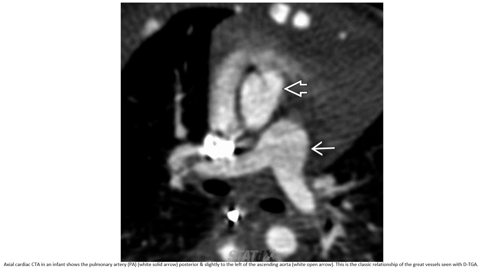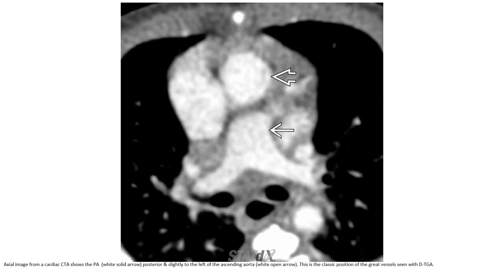Axial cardiac CTA for assessment of coronary artery anatomy: the pulmonary artery is posterior and slightly to the left of the ascending aorta. This is the classic relationship of the great vessels seen in D-TGA.